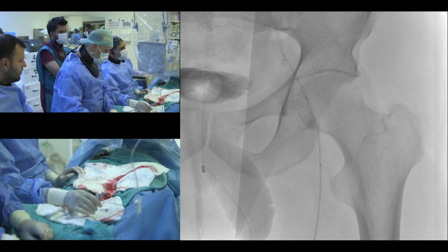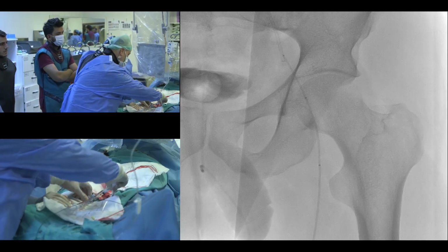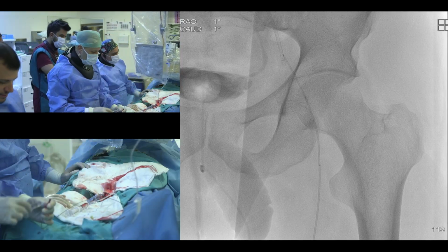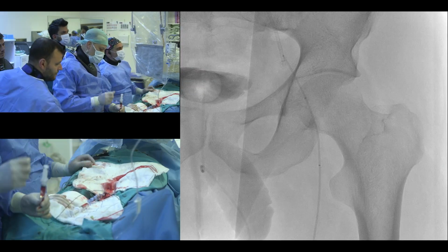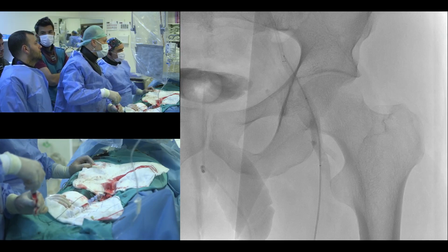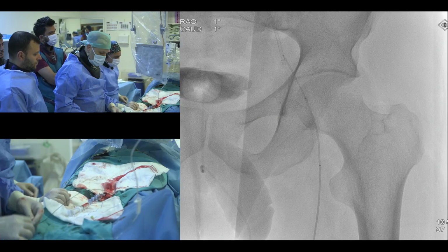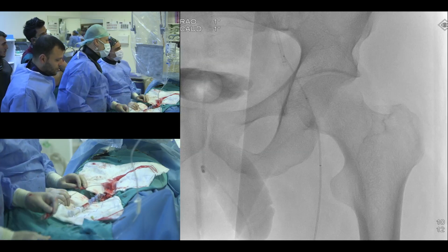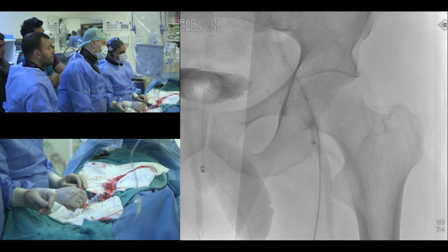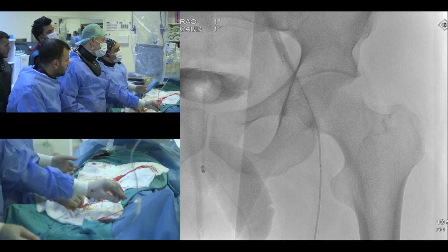We will check through the lumen if we are in control. Yes. I think you crossed the occlusion. Yes, it's bleeding. Veriyorum. Evet. Tamam. Yes, we are in the true lumen. Through lumen, but we will try externalization, retrograde wire, antegrade guiding catheter.